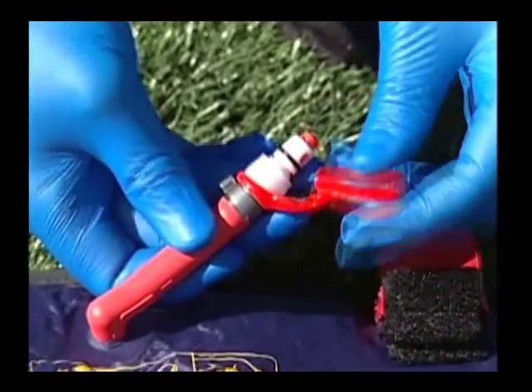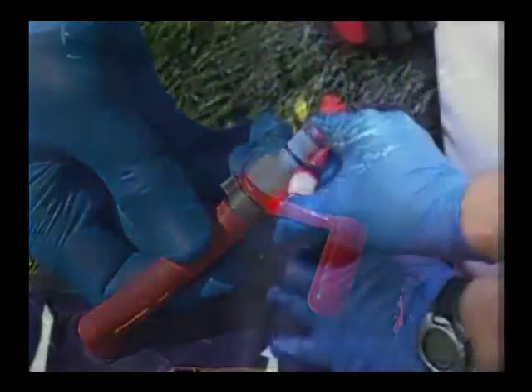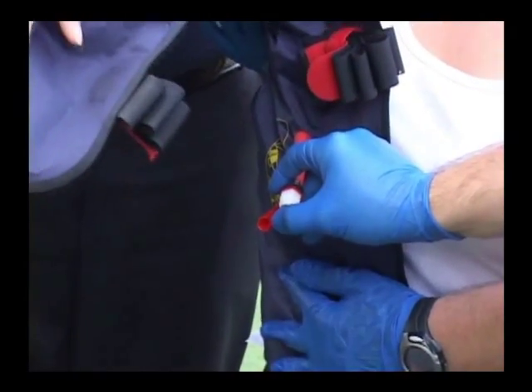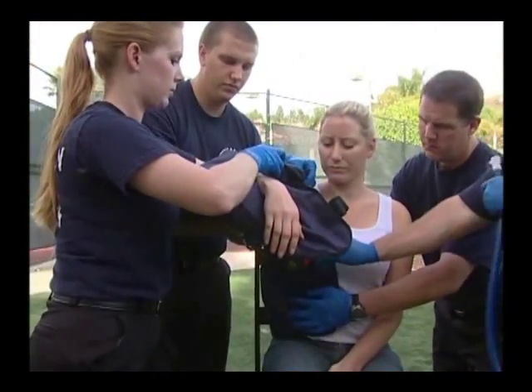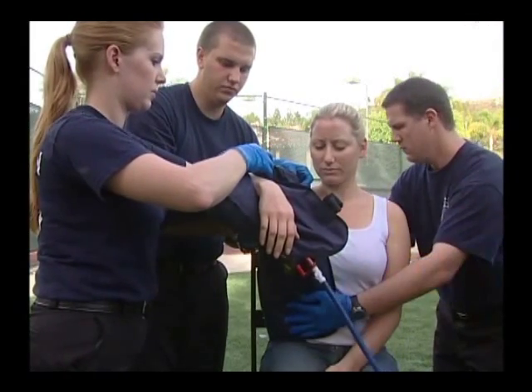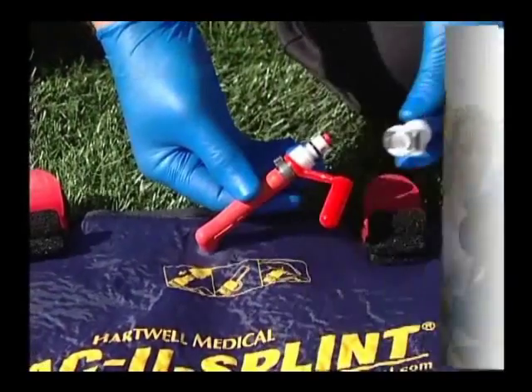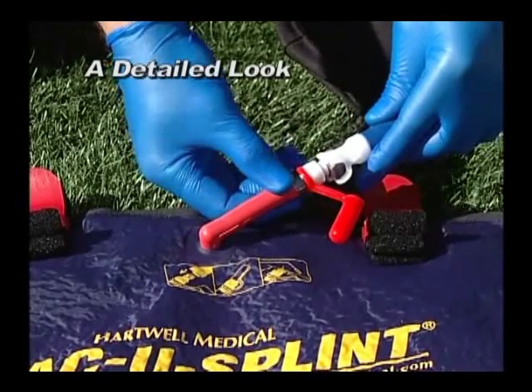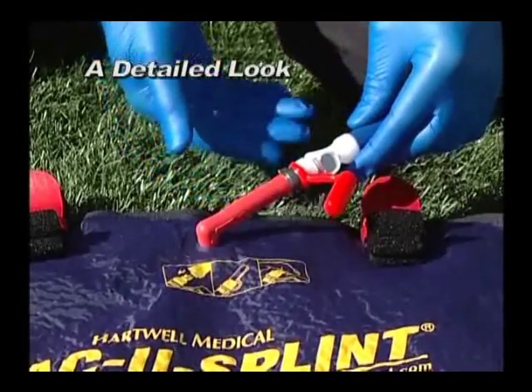Remove the red leash cap from the maxivalve and push in on the red end of the valve to equalize the air pressure in the splint. While holding the flange tubing on the splint, connect the maxivalve female coupling on the pump hose to the maxivalve on the evacu-splint. You should hear a click when the connection has been made.